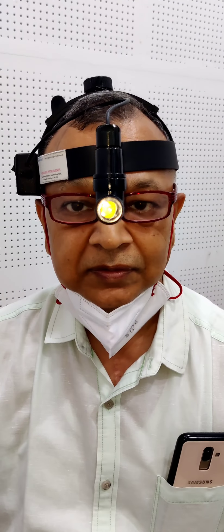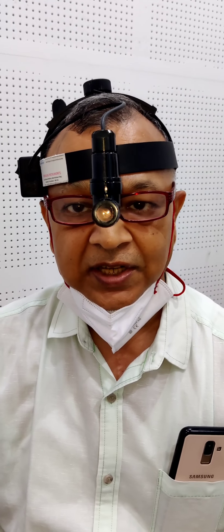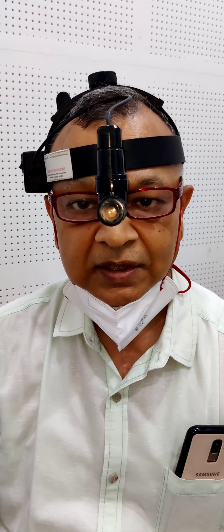Hello friends, how are you? In today's clinic, I will show you the method of examining the nose.